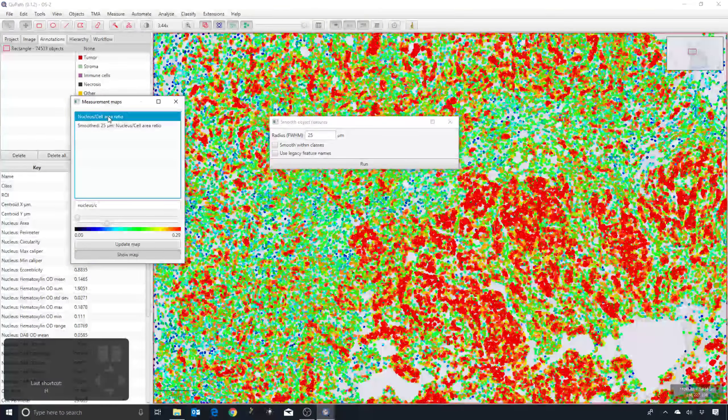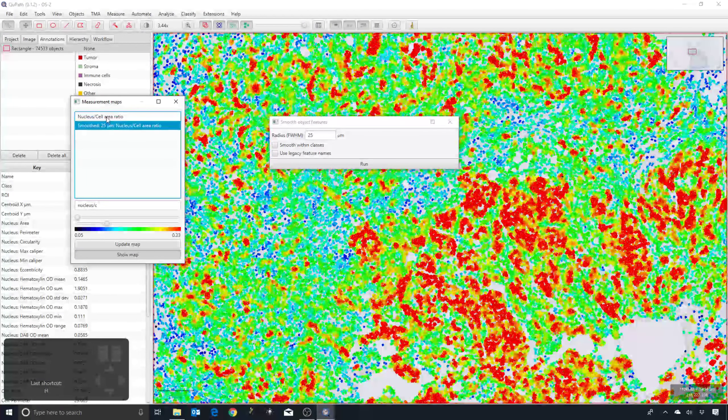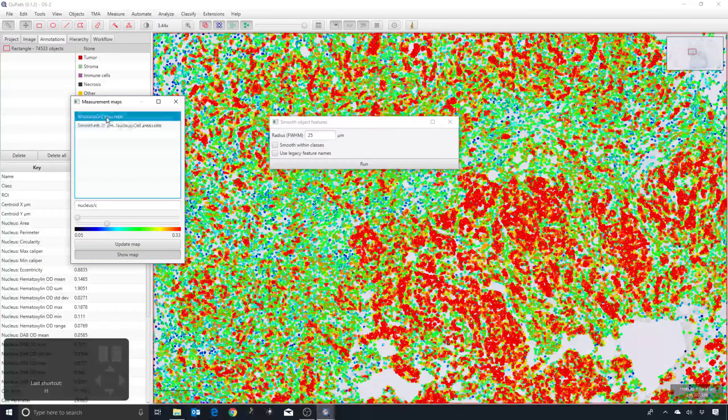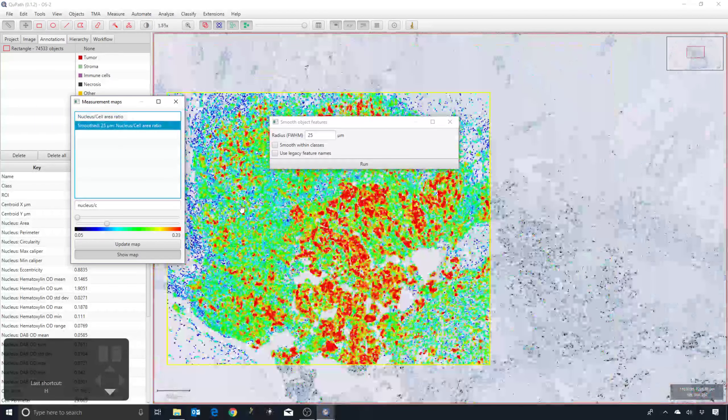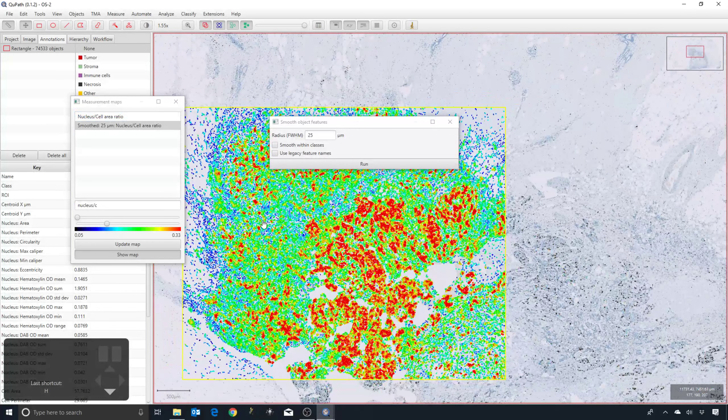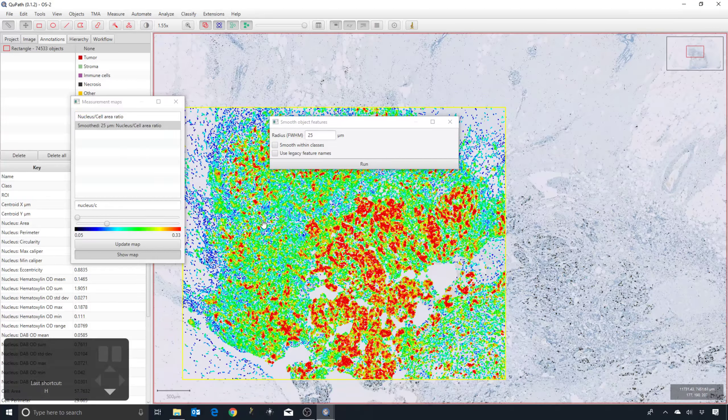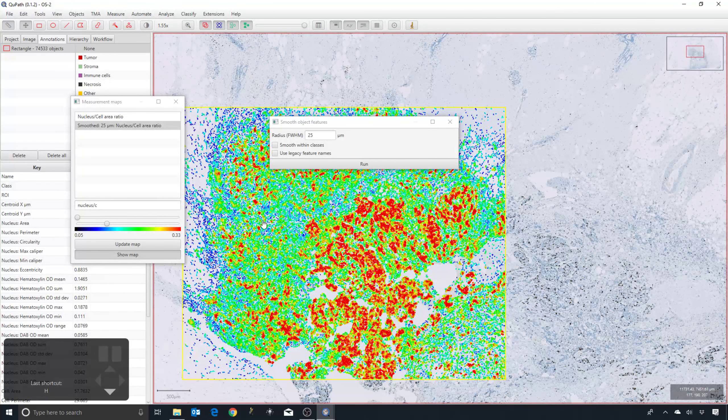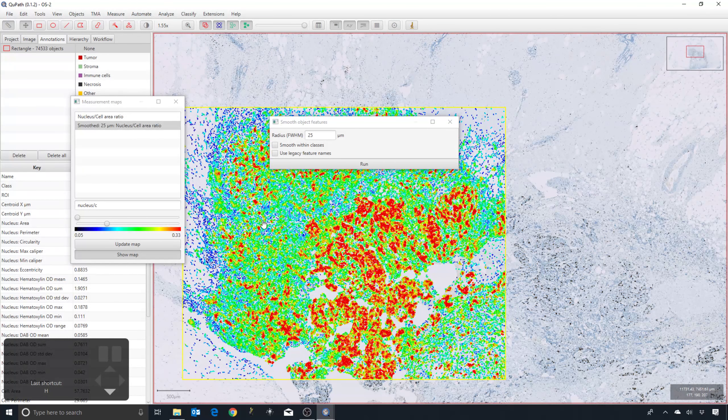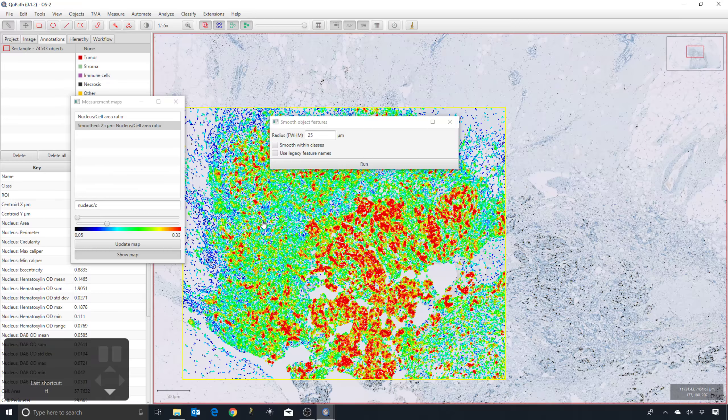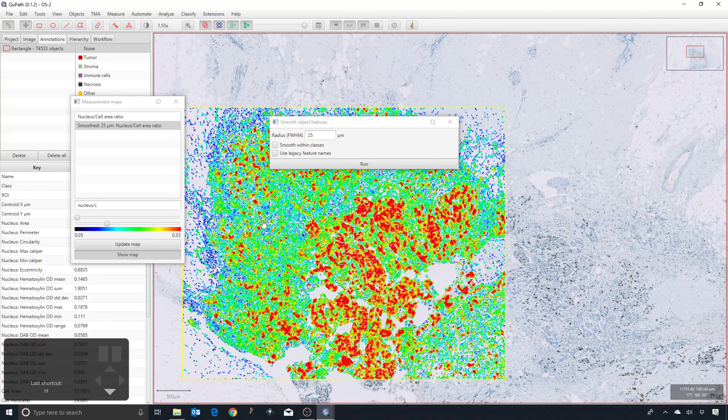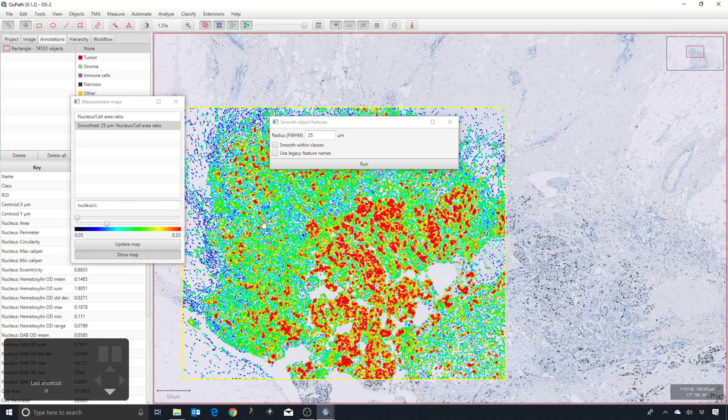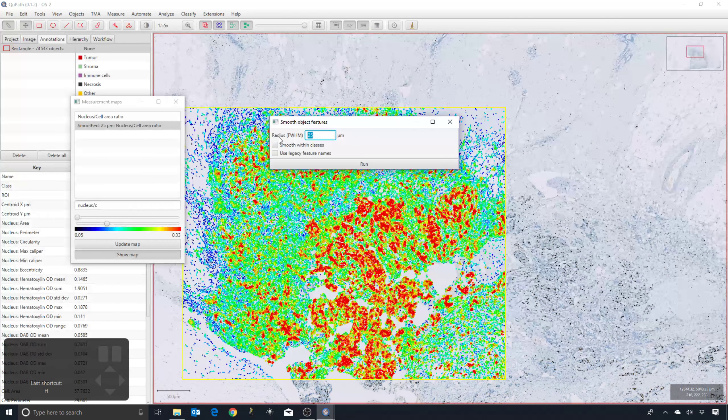In a moment, as we're going to try and get QPath to learn how to classify the cells, we'll see that having these smooth measurements can help the classifier come up with more sensible results. Because for each individual nucleus, the proper classification of it is easier to make if you also know a little bit about the surrounding cells, and this essentially gets that information into the software.